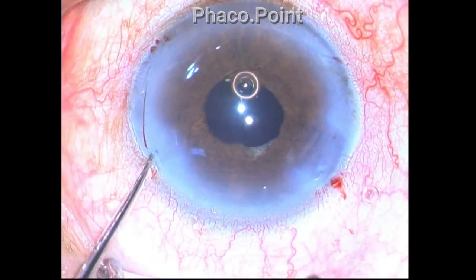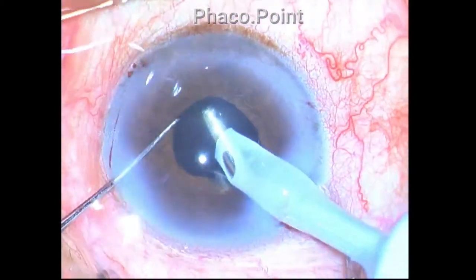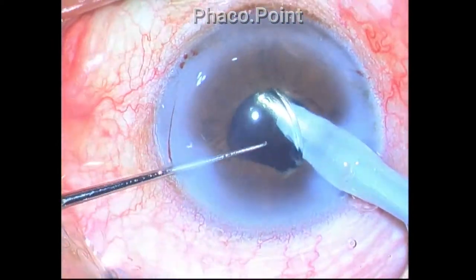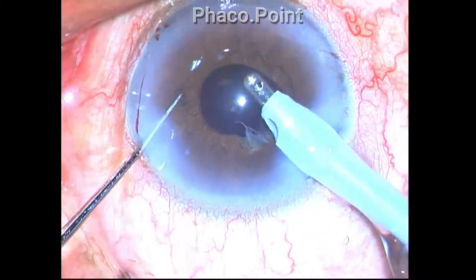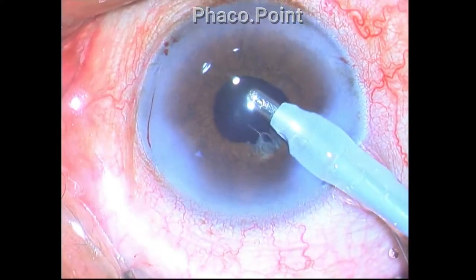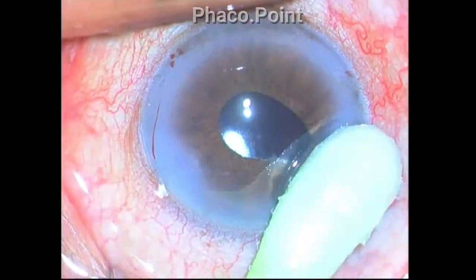There are several tricks proposed in the management of IFIS: use of epinephrine at the start of the procedure, use of iris hooks to prevent pupillary shutdown, and keeping the iris away. What I propose through this video is that if chafing occurs and only a small portion of the iris is chafed, you can still proceed with phaco — using a ball dialer temporarily to keep the pupillary edge away from the probe without resorting to iris hooks.